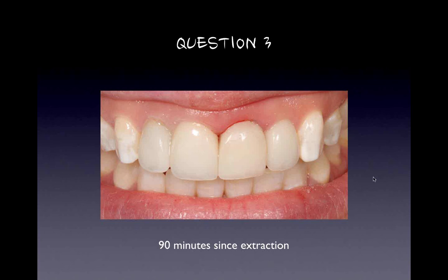What material thickness do you use for clear matrix? 0.020. When you use a matrix for the Omnivac, how do you prevent the composite from binding between the teeth? It doesn't. It binds between the teeth, then I separate the teeth, and then I just use my little matrix to create a new contact. So you're going fast on the four teeth, but a little slower when you're doing the interproximal contacts. Every technique has its pros and cons. Remember, nothing's easy and perfect. There's always going to be some trick to each technique.